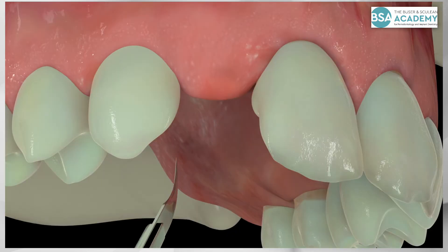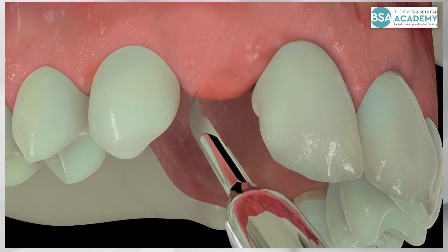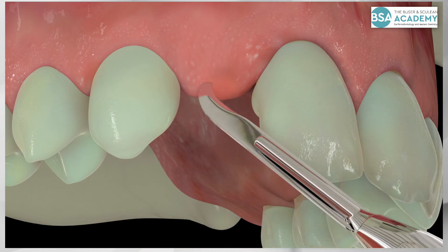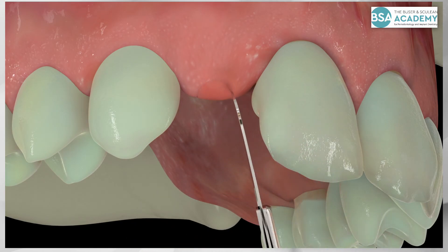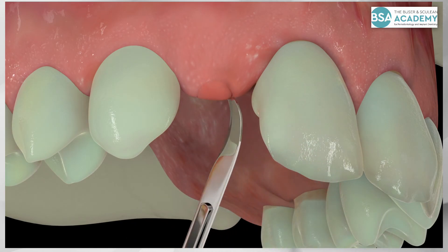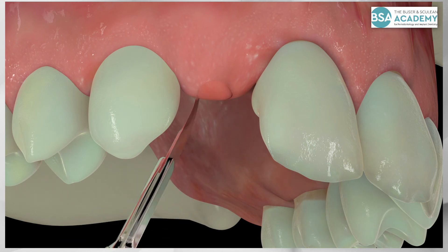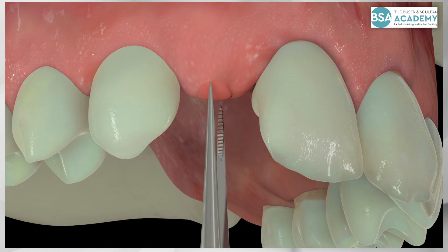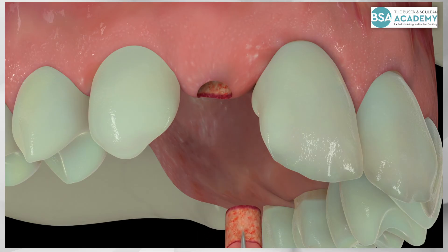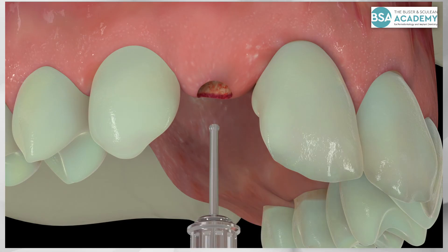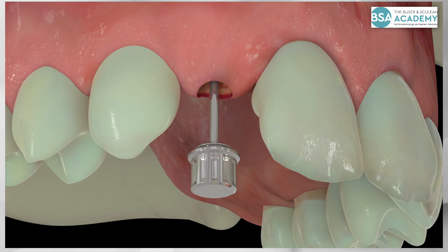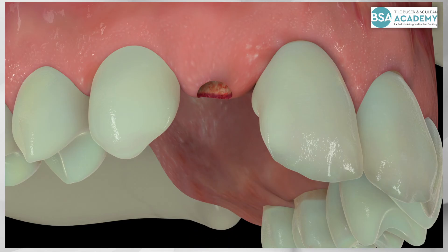Eight weeks later, a re-opening procedure is done with a punch incision using a 12B blade. The healing cap is removed with a screwdriver and replaced by a longer one.